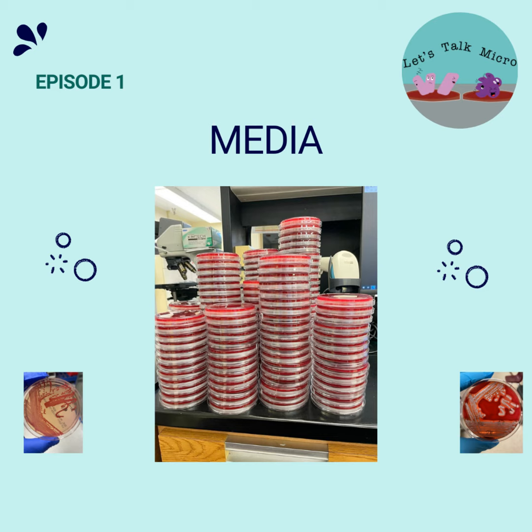So here is where I go to another great resource that has no affiliation to this podcast. I go to an ASM book, American Society for Microbiology. They actually establish the procedures on what media we use, how to properly work up the cultures, basically what we need to rule out on a particular source. And as I look up information on this organism, Pasteurella aerogenes, it grows on Mac, gram-negative, coccobacilli, biochemicals match and everything. And it says it is normal flora in pigs. So it is caused by pig bites.